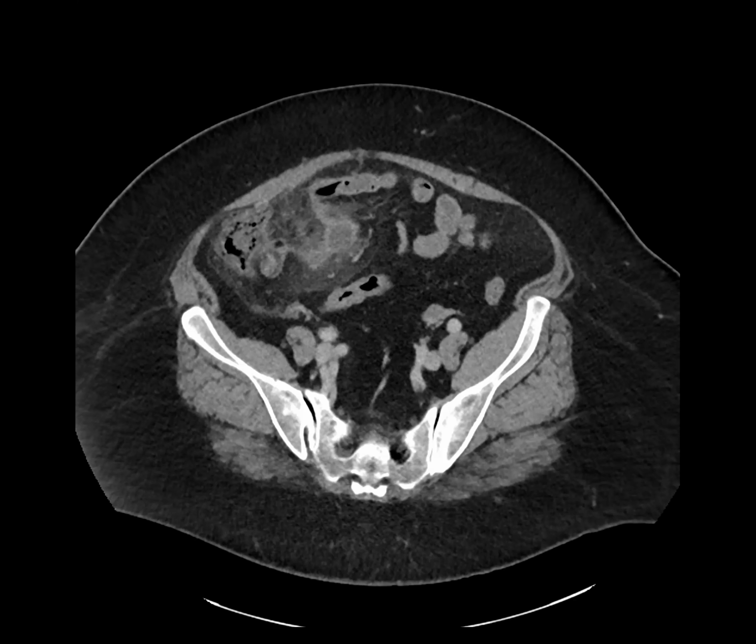And I learned the reason. What they use is 99m technetium pertechnetate, and it works like a halide anion, like chloride and iodide, and gastric mucosa secretes chloride, right? Hydrochloric acid, that helps with digestion. And so the gastric mucosa accumulates the pertechnetate and then secretes that into the intestines, and that's why it lights up on the pertechnetate scan. Again, only if it has gastric mucosa.